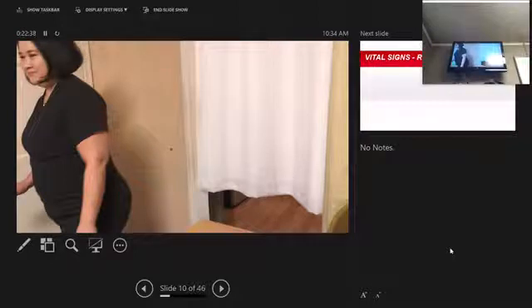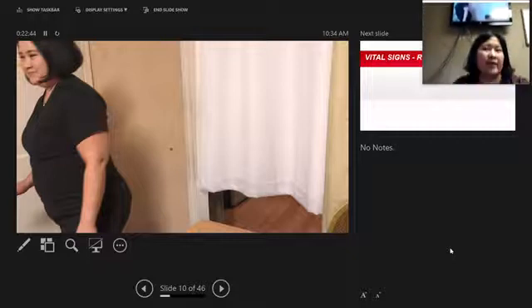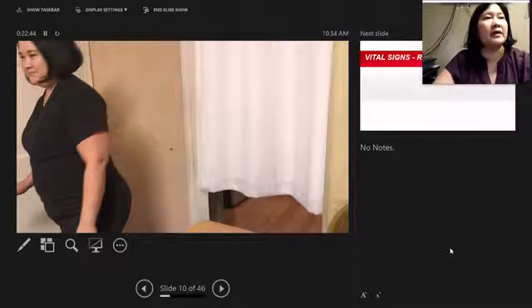For 1 full minute. We're also going to report it to the nurse immediately. Okay, thank you. You're done. There's your call bell. I'm going to wash my hands, then use the pen and record each part, writing our results and the candidate's results, measuring and recording your pulse.